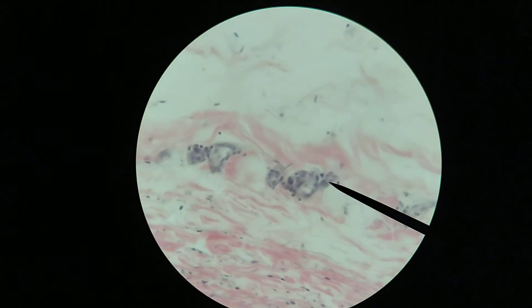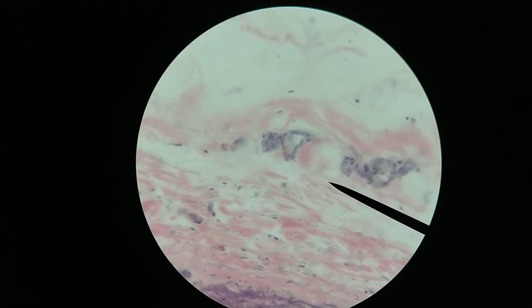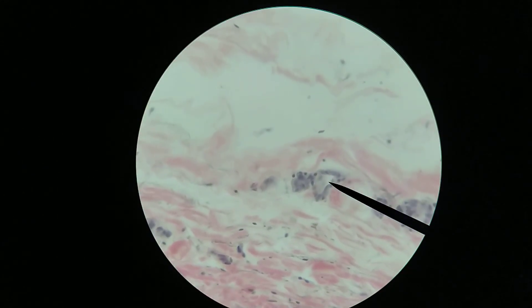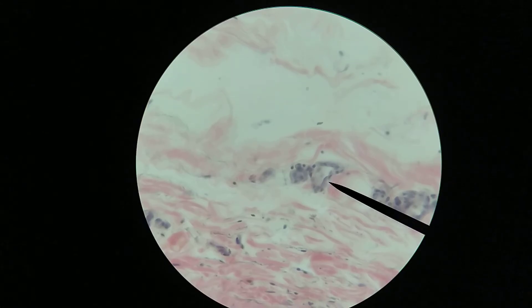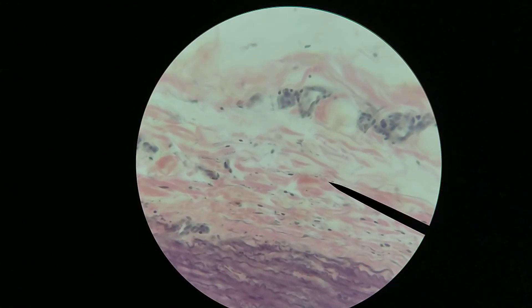Within this region also we see some smaller blood vessels. So this is the vasa vasorum. This is the vessel of a vessel. What you have here are smaller blood vessels that are bringing oxygen and nutrients to the deeper layers of this blood vessel.